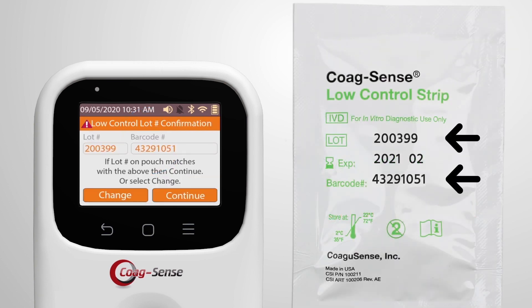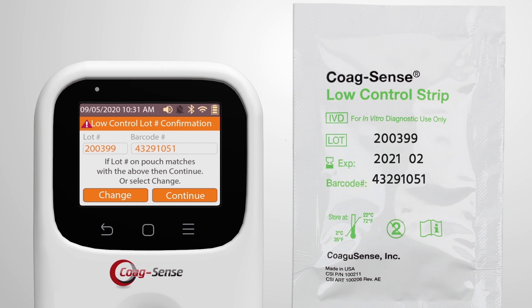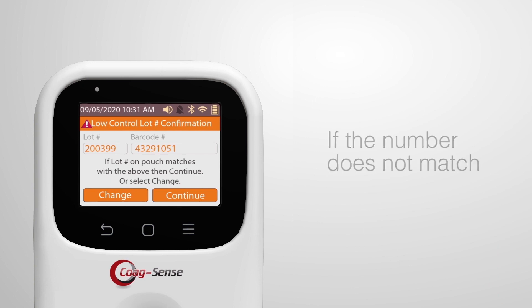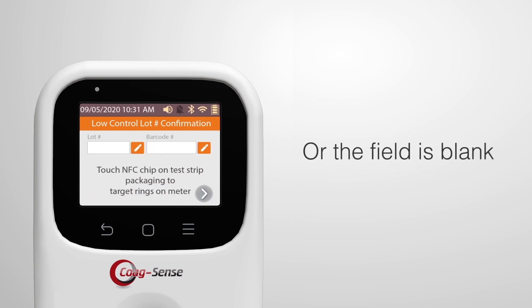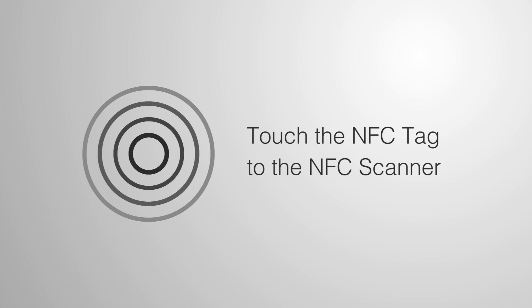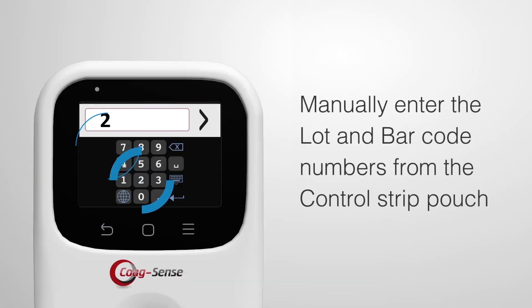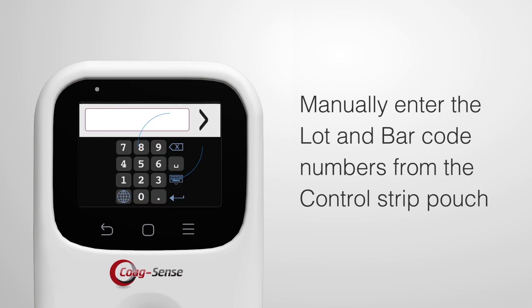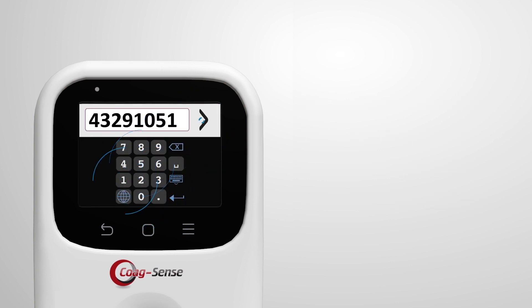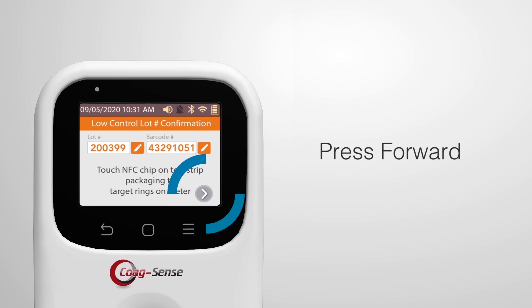Confirm that the control strip lot number displayed matches the lot number on the test strip pouch, then press Continue. If the number does not match or the field in the meter is blank, touch the NFC tag to the NFC scanner on the meter. If the NFC tag is not available, manually enter the lot and barcode numbers from the control strip pouch, then press the forward button.